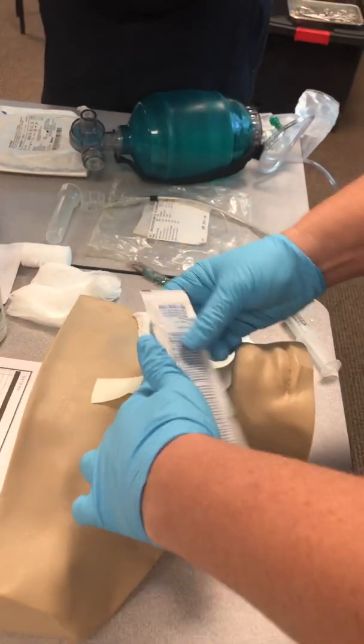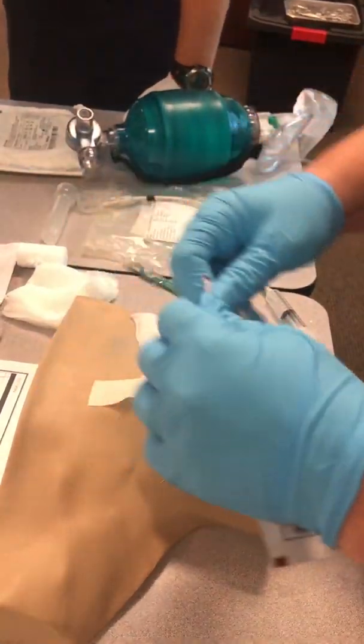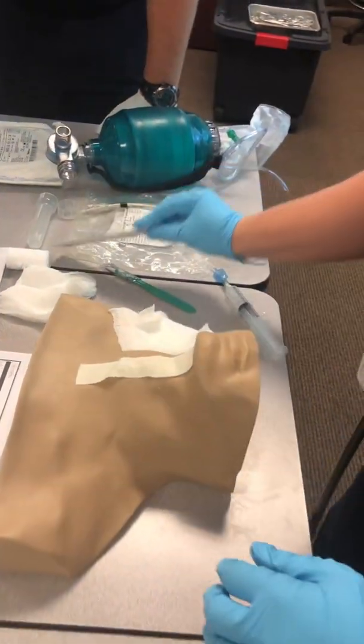Go ahead and prep the site with the betadine. Get that in there, prepping it. We've simulated the preparation.